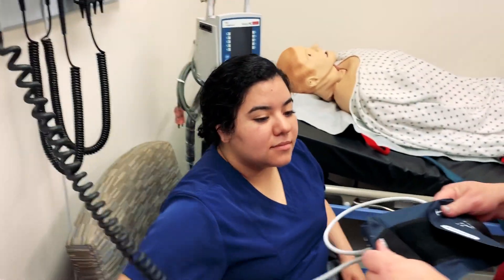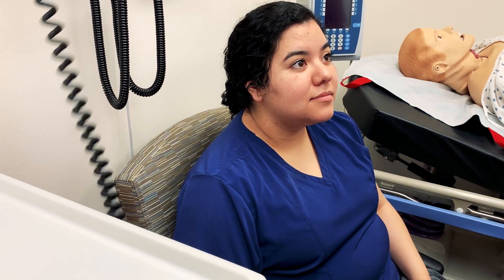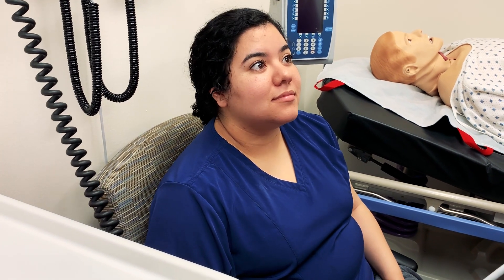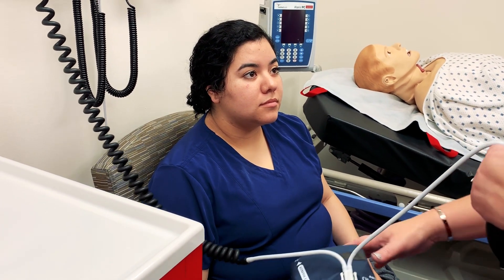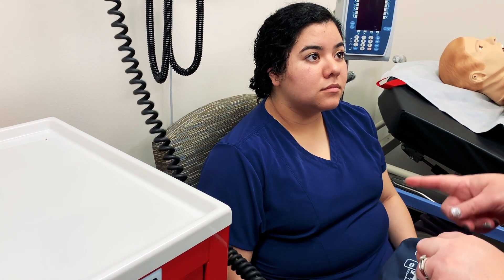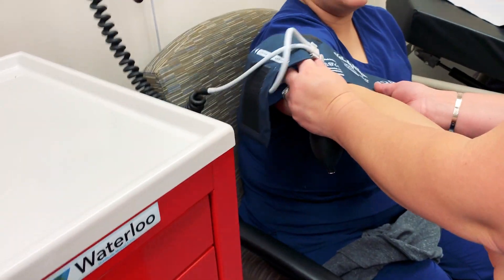Back to our patient — the first thing you want to do is make sure your patient doesn't have a preference for arm. Have you had a mastectomy, fistula, any AV grafts or anything in either arm? Those are all reasons why you could not take a blood pressure on a specific arm. Since she hasn't, we'll go with her right arm.